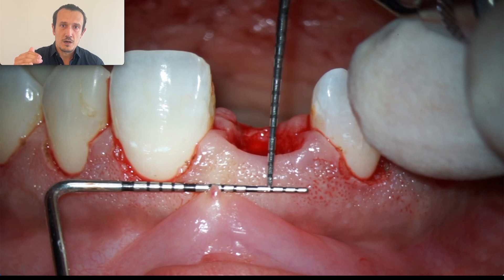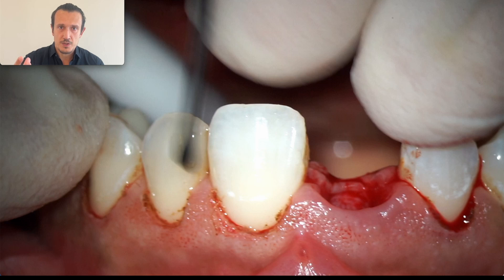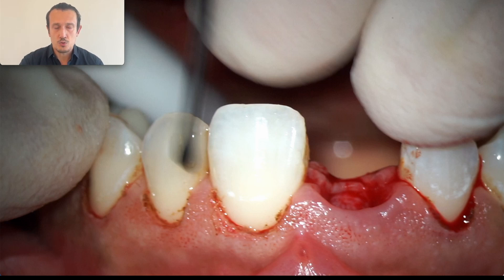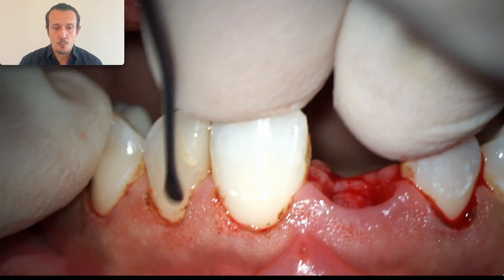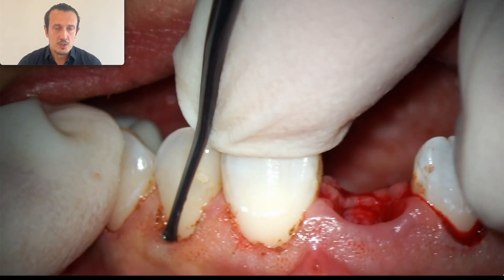In order to achieve three to four millimeter depth of the implant, we need to go five to six millimeters from the existing soft tissue margin. We are not going to remove this soft tissue — we're going to keep it there because it's going to be in excess and it's going to compensate for the shrinkage that we're going to have.